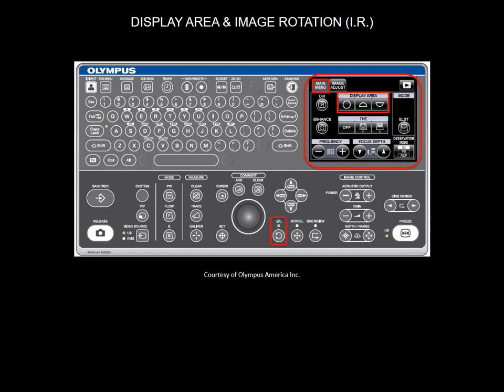If you are using the radial EBUS, you can adjust the display area to full circle, top sector or bottom sector. You can also use the image rotation button, or use the trackball to rotate or move the image as desired.